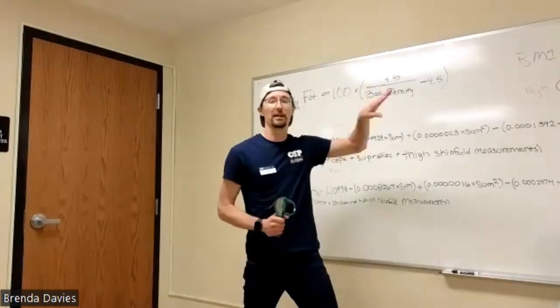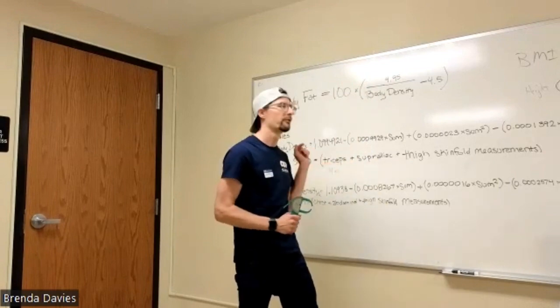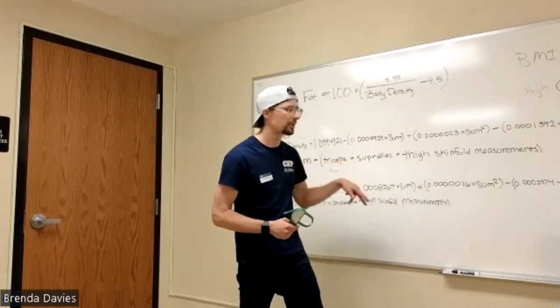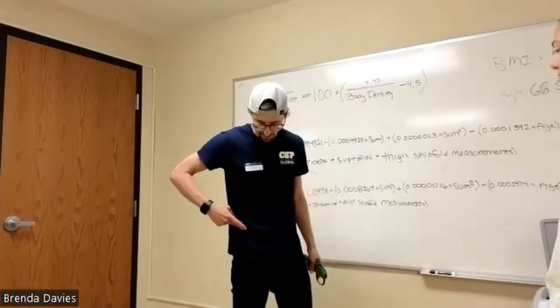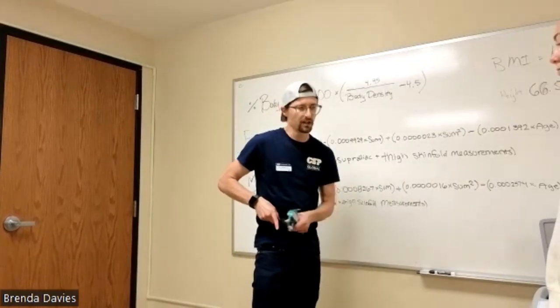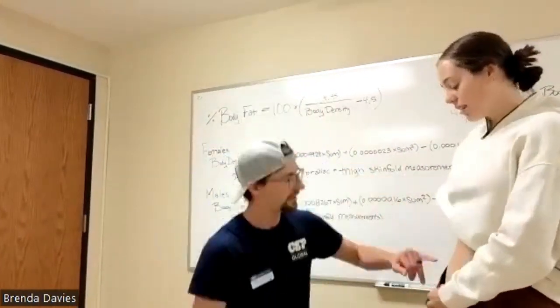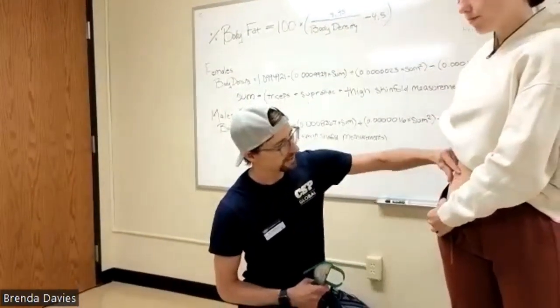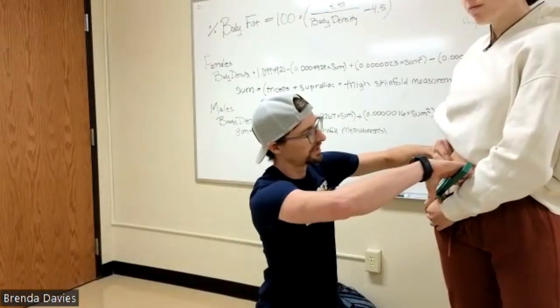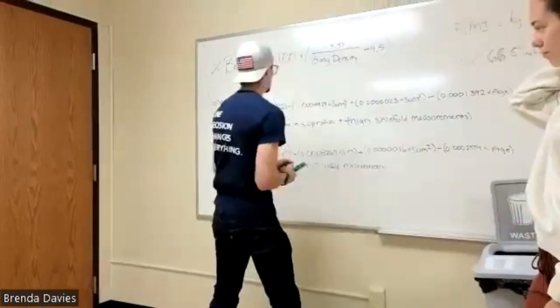So like the circumference, you do 3 measures at each site, working your way through one at a time, going through 3 cycles. For the purposes of our video, we're only gonna do one at each site. So, triceps, suprailiac is the next one. So the suprailiac is gonna be kind of right at that ASIS in a 45-degree angle. We're gonna take that pinch and measure that. So, yeah, yep. Just, yep, right there. Yep, perfect. So I'm gonna find that spot, go at a 45-degree angle, measure right below the pinch. So 7, release the caliper first, and then release the pinch. Okay.